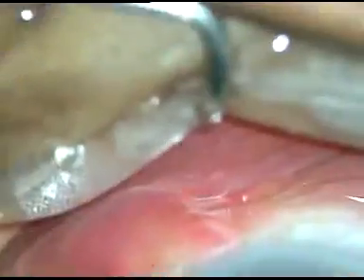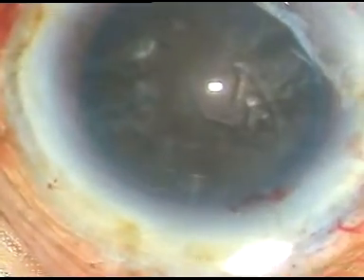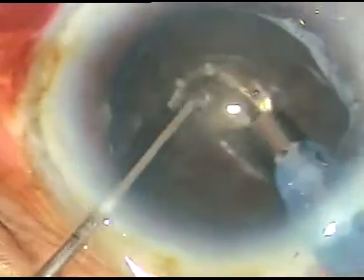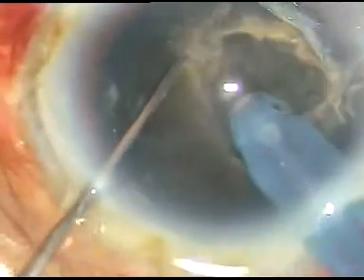What to do with this hard nucleus? What should be our approach? What I do is I debulk the hard core of the nucleus — I make a crater. I start from the anterior pole of this hard nucleus. I place the bevel down and I start sculpting from the anterior pole. Why bevel down? Because with this application of energy, I can remove more lens matter, and the whole energy is directed over the nuclear mass. It goes posteriorly; it doesn't dissipate sideways, so the total energy applied is fully utilized. This bevel-down position to make the crater is one technique we can employ.